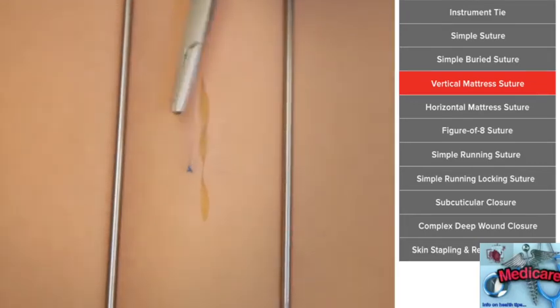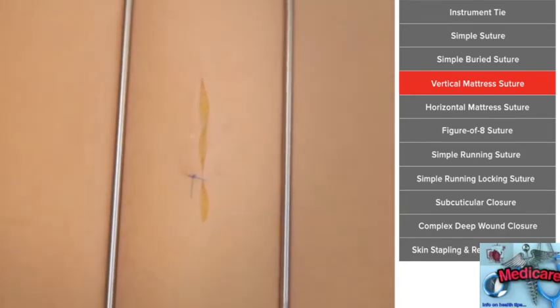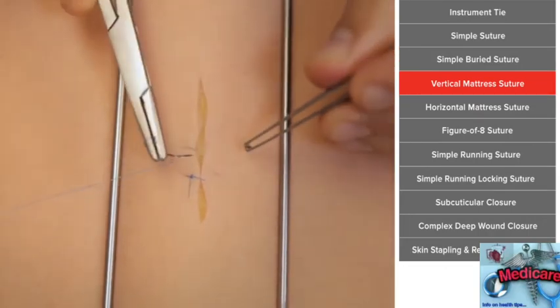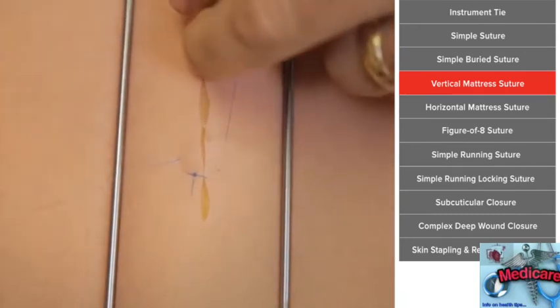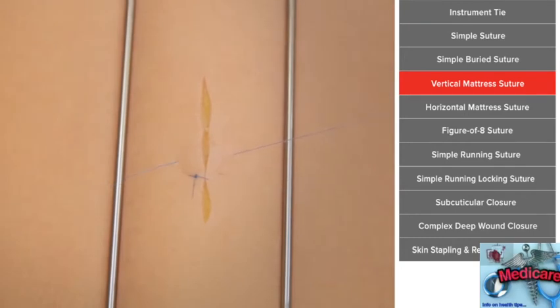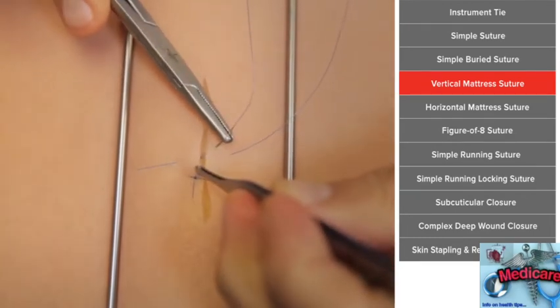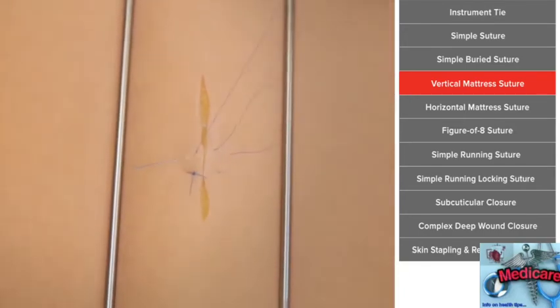And this is a more secure closure because now what you're doing is you're actually grabbing a bunch of tissue and a bunch of tissue, and it's pulling the skin edges together, but there's no actual stitch in the actual edge of the skin. So again, deep, run along the bottom of the dermis and come out about the same distance on both sides, turn the needle around, and now you want to get pretty close to the edge of the skin because it's the distance between those two bites that gives you your strength. Do the same on both sides, and then again go ahead and do your instrument tie.